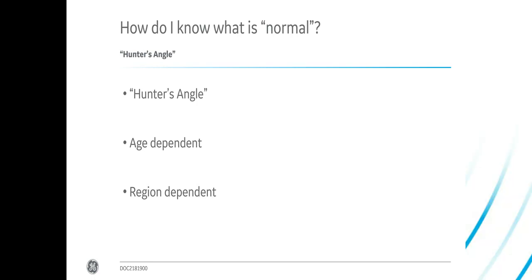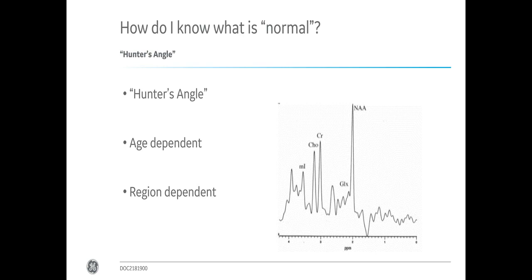And for that, we look at the typical spectrum, and I learned also spectroscopy or the clinical use of spectroscopy during some courses at Huntington Medical Research Institute a longer time ago, when Brian Ross gave these courses, and even earlier than I started doing spectroscopy, people also ask, what is normal?